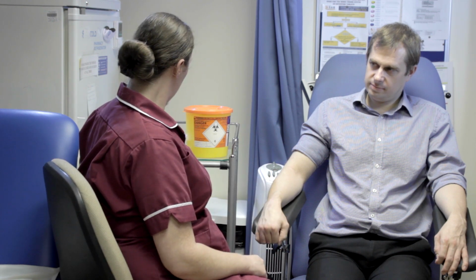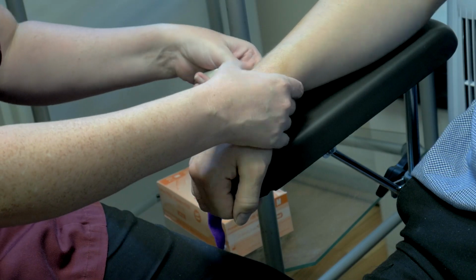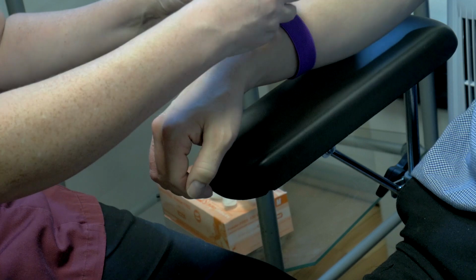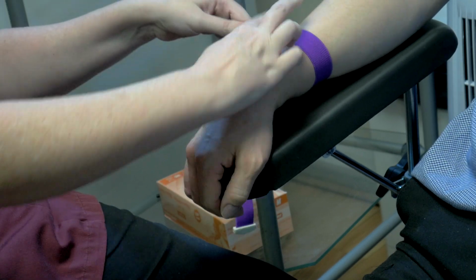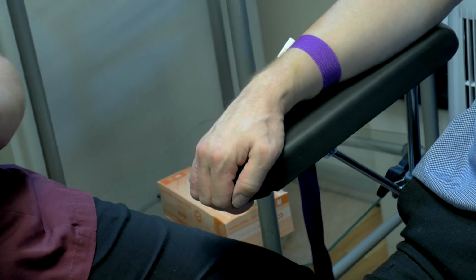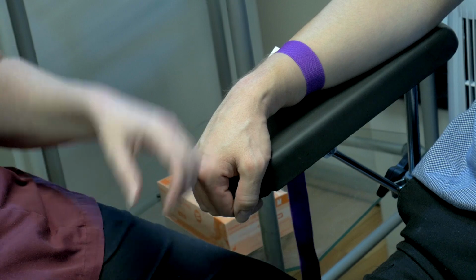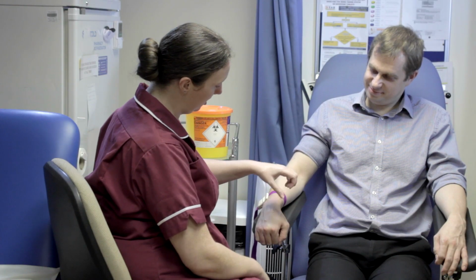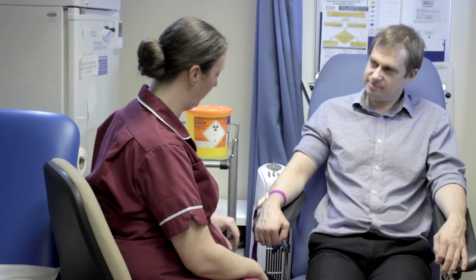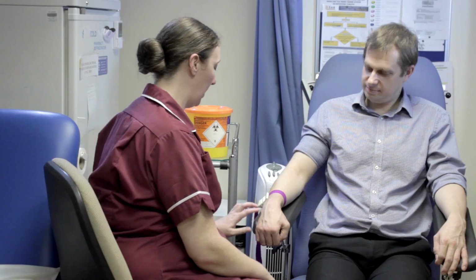After I've done that, I'm going to pop my tourniquet on. Now, because we're doing a hand, we're going to pop our tourniquet on just a little bit above the wrist and pull it nice and tight. I'm then going to get the patient to loosely curl their fists, so just a loose curl please. You don't need to squeeze, just a nice loose curl, just as though you're holding a bike handle, but loosely.